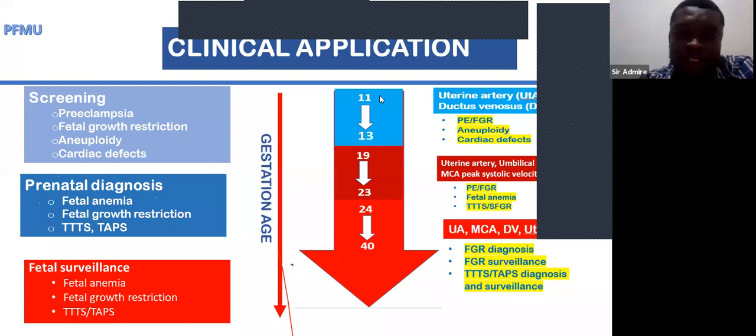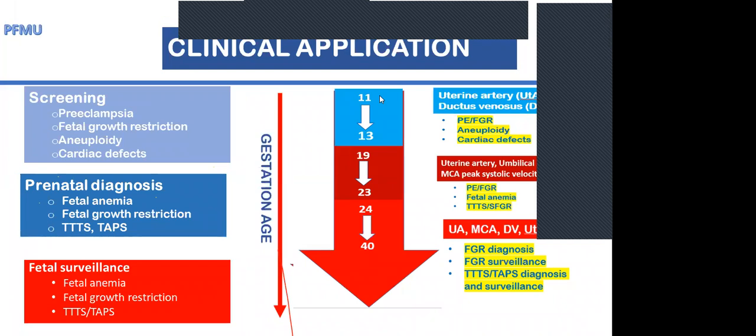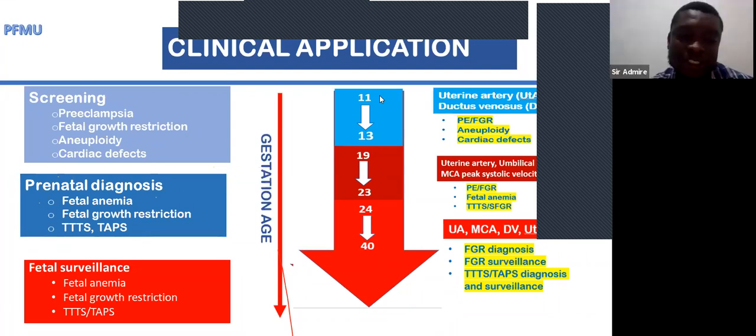All right. Definitely, if you put too much pressure on the head, it can have an effect. So in terms of the real scanning, I think this one was just an introduction. In terms of each of the individual aspects, there are more layers to each on how to perform them, which I couldn't put in just one presentation.